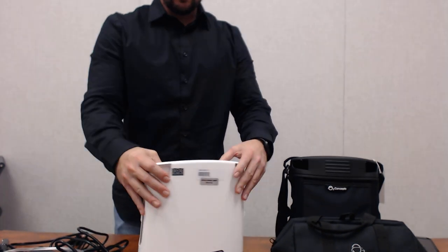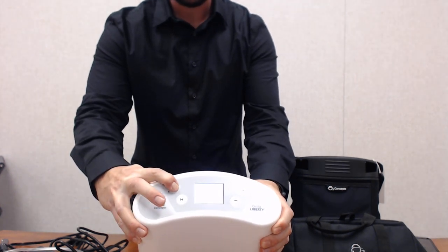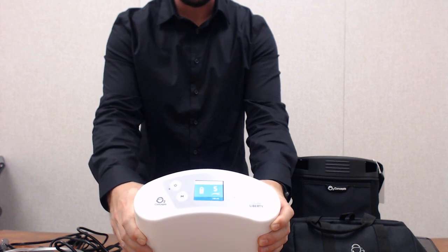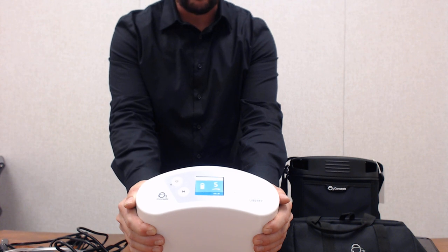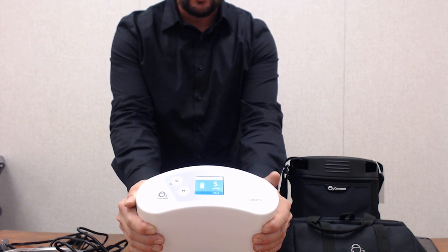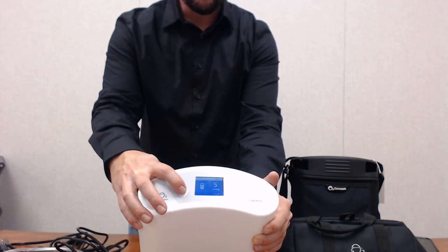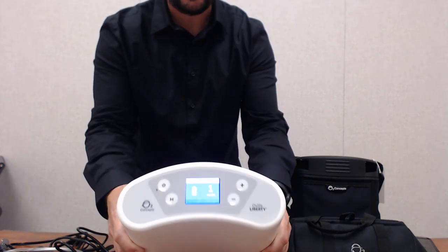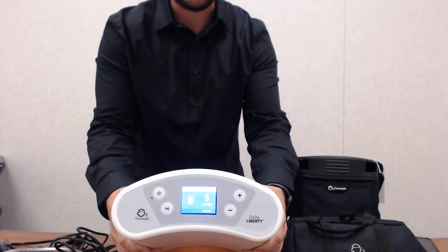To operate the device, you simply hold the power button in. This device can do both pulse dose and continuous flow. We can switch between the modes using the button with the letter M on it for mode. If you push it and see a series of dots, that is pulse dose. If you see an arrow, that is continuous flow.